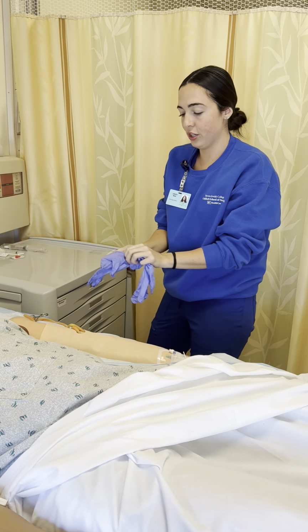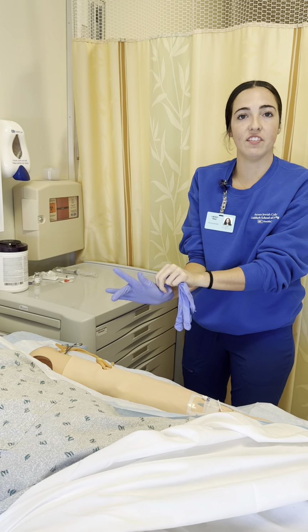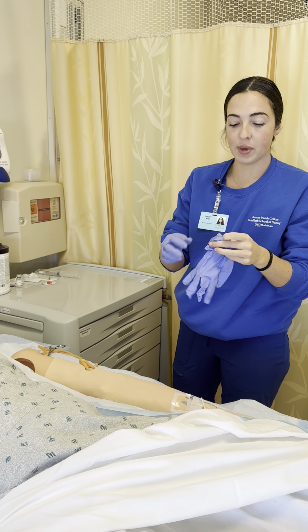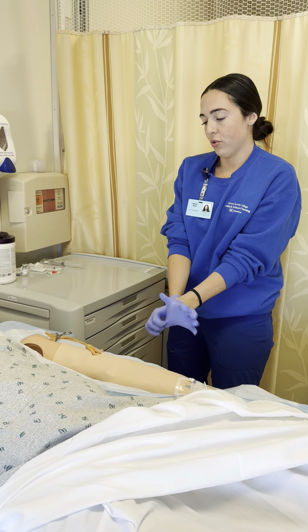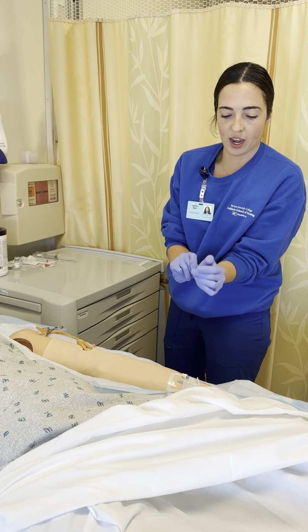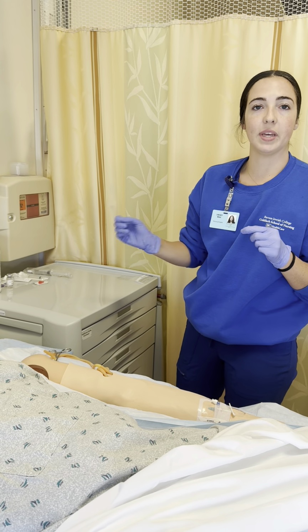So the next thing that we're going to do is we are going to prepare our medication for the IV push. So this is going to be my second med check, and I'm doing it here while I'm preparing. We've gone over with Ivy what our next steps are, so I'm just going to go over again kind of while I'm getting everything ready.